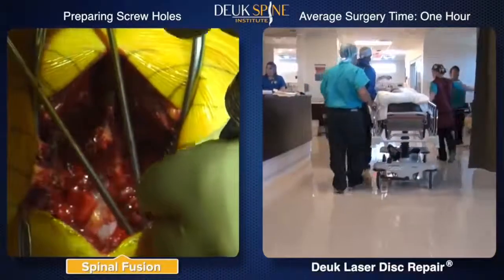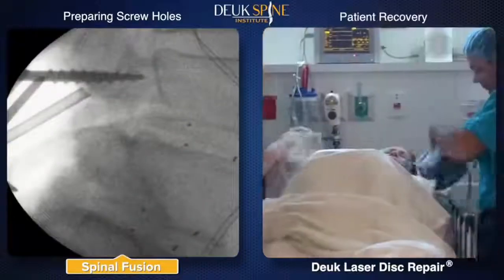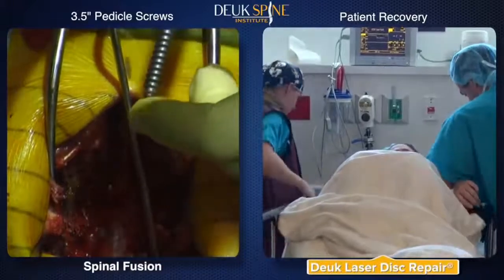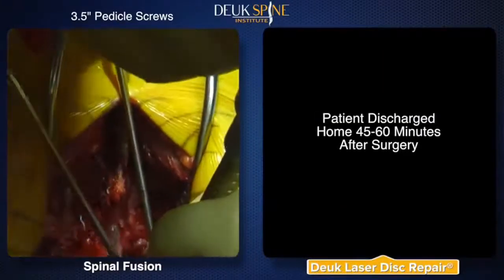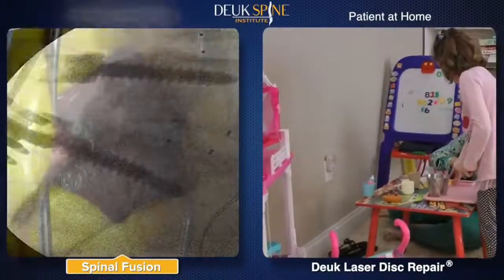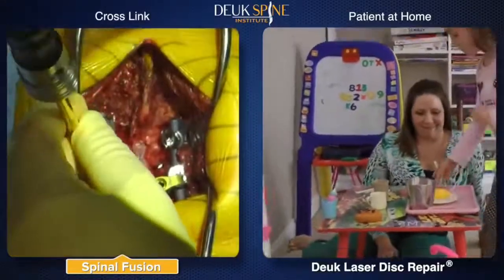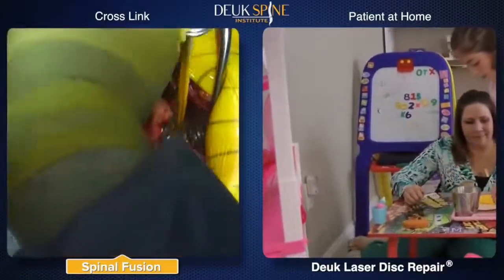The fusion, however, is still underway. Holes in the spine must be tapped in preparation for the large pedicle screws that anchor the fusion hardware. The Deuk laser disc repair patient is in recovery usually 45 to 60 minutes before being released to go home. The fusion screws are inserted into the bone, as shown in the X-ray. After all screws are in place, rods are used to connect the screws together to prevent movement of the secured vertebrae. Cross links are added to bridge the rods together for additional stability.